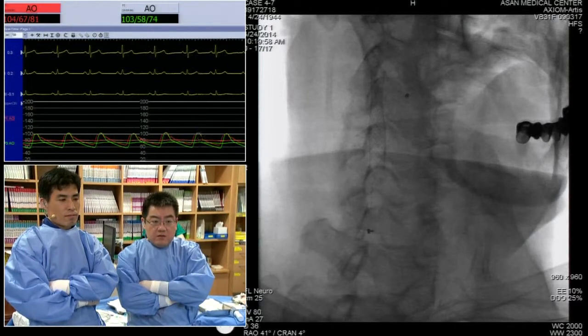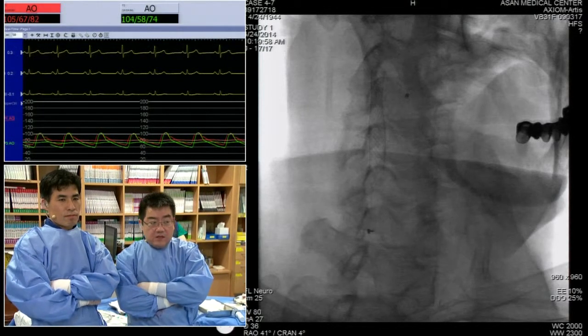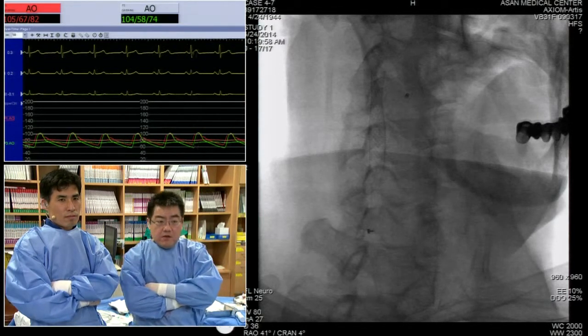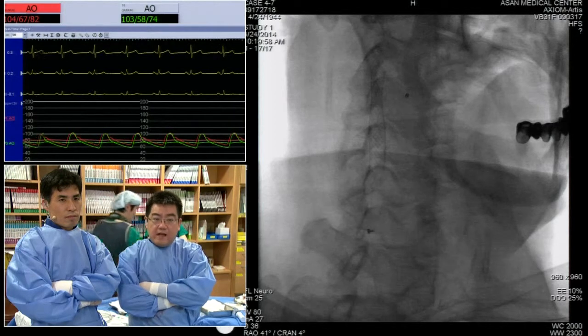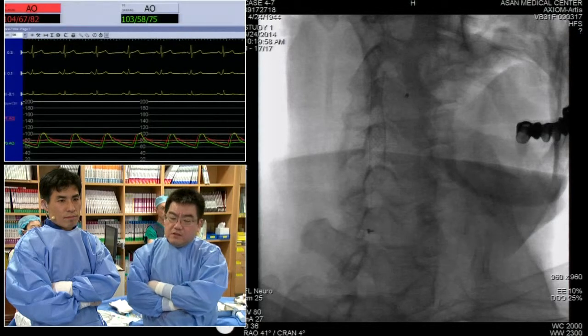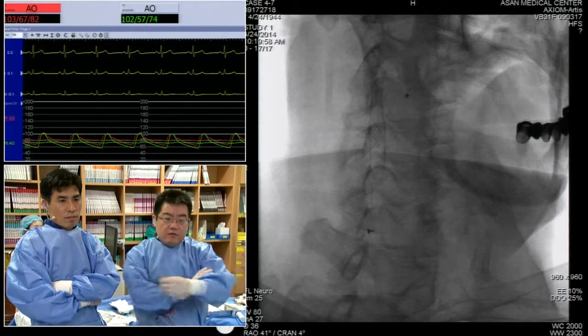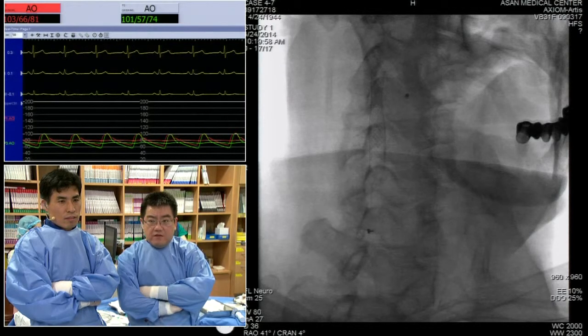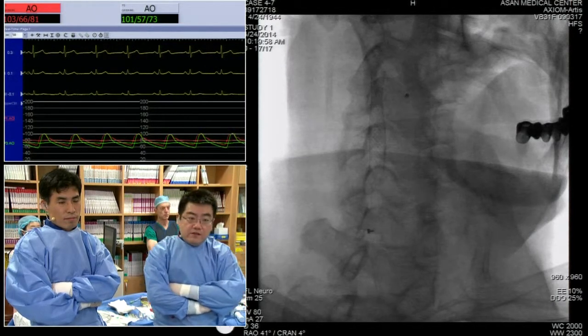So in those cases, we can still use a coronary wire and a microcatheter and try some maneuvers like I have mentioned: a very focal, small dose of heparin, sometimes nitroglycerin to release some of the spasm so that the clot can move more distally. We also have several experiences of balloon angioplasty for a very distal M2, beyond-M2 emboli. These patients can be salvaged, and the neurological deficit will recover, at least partially.